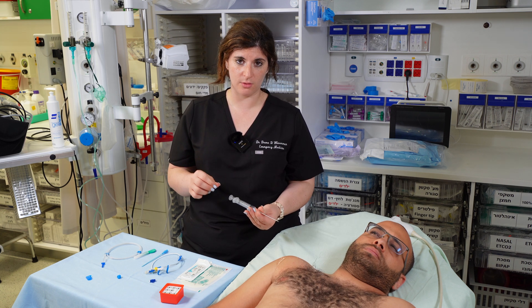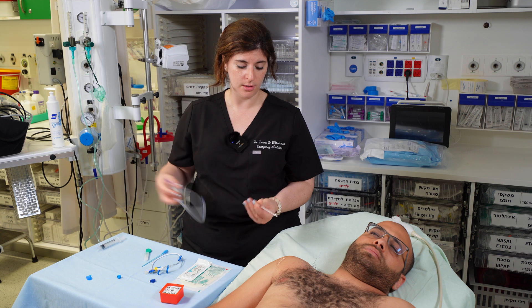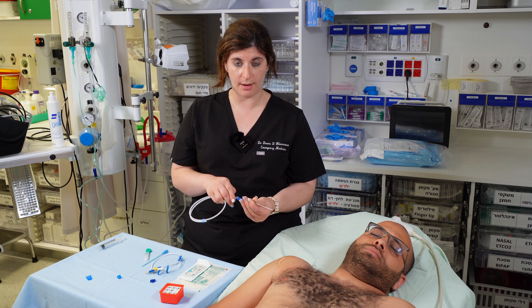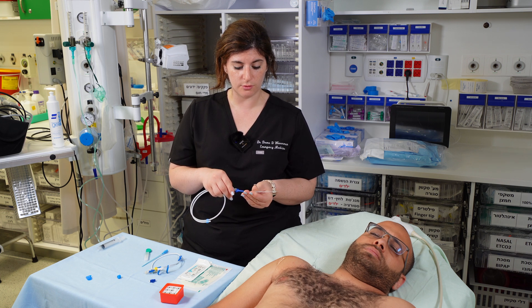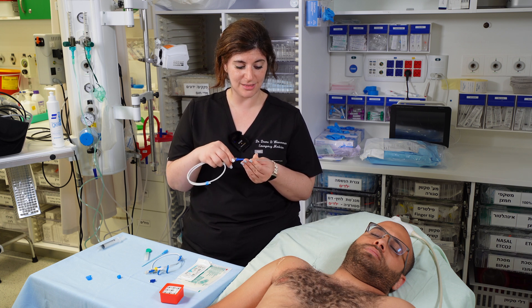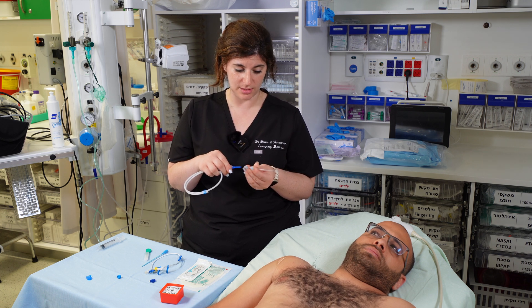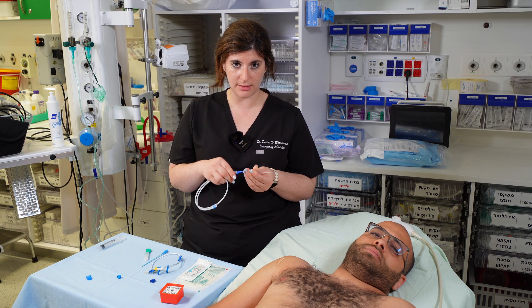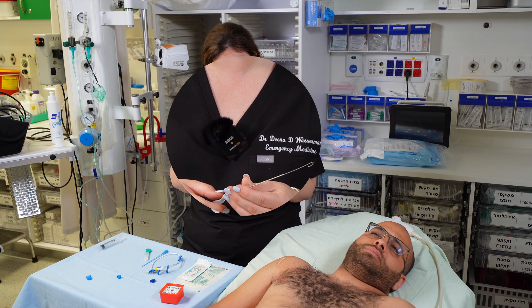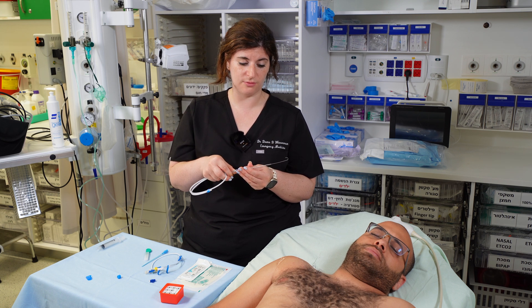Once you're in the vein and you get flash, drop your angle so the wire doesn't go to the back of the vein when threading. Hold the needle steady and start threading the wire. The first few centimeters will go smoothly while the wire is still inside the needle; once it exits the needle you'll feel a little resistance — that's okay. If you feel stuck, there's a small hook at the end of the wire that may be hitting the back of the vein; try spinning the wire so the hook faces a different direction.